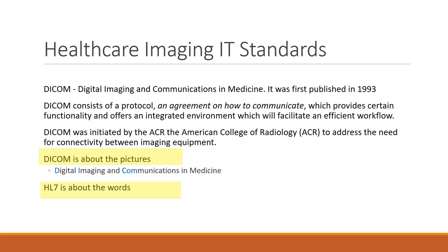So anytime you're talking in a group or project meeting and it's about moving images across, viewing images, whether it be through a portal, through the PACS, a new workstation, a remote workstation, that's DICOM movement. If you're talking about getting information about the patient, the bed update, the imaging report, anything other than images, it's HL7. That's the language it's speaking. Those two are very distinct and will be a big piece of your feeling good about what you're talking about in meetings coming up about these projects.